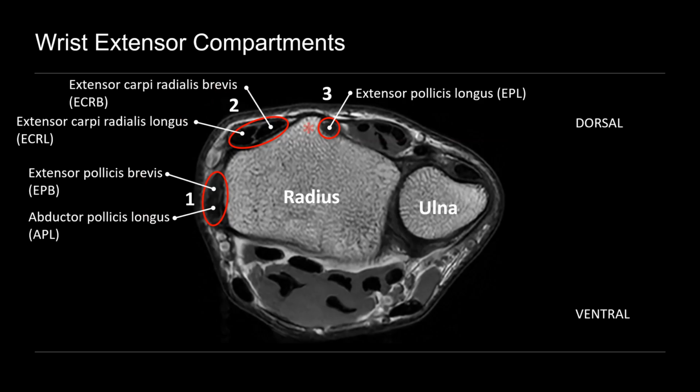And also there's this little bony protuberance there at the dorsal side of the radius. You can see that's in between compartment 3 and compartment 2. That's known as Lister's tubercle. So that's a useful ultrasound landmark, and it's also helpful when dividing up proximal and distal intersection syndrome.